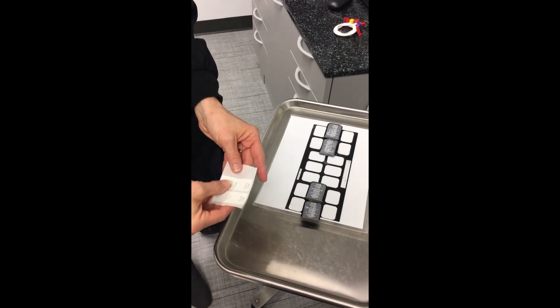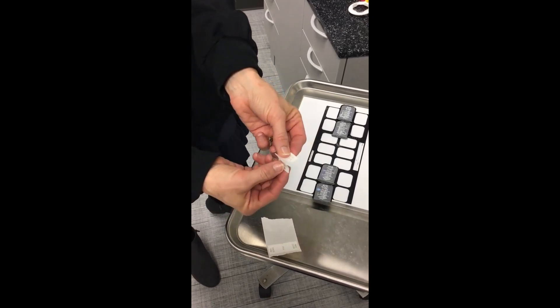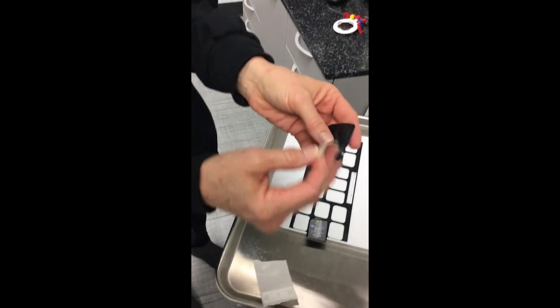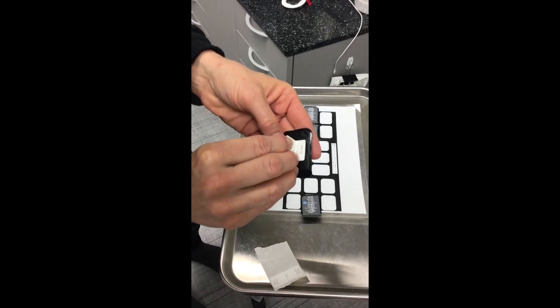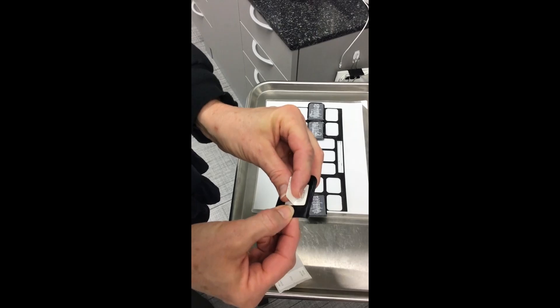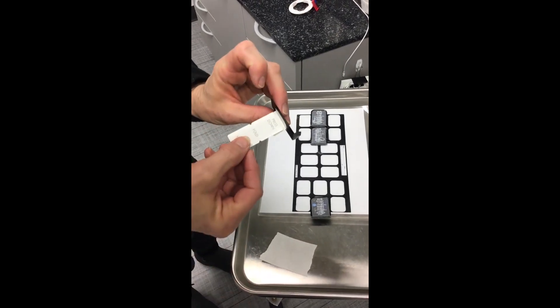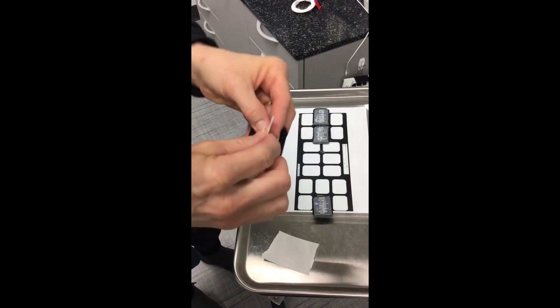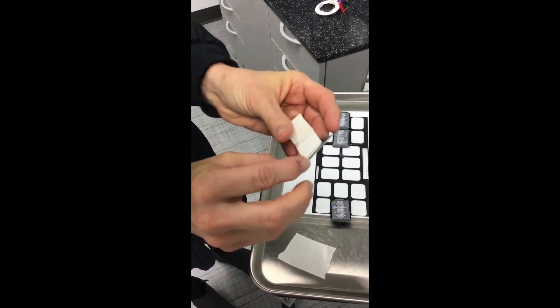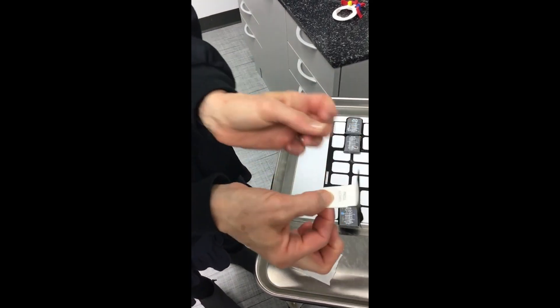Now we're going to demonstrate how to take horizontal bite wings using the tabs. Pull the tab off, fold it in the center, and make it like a little wing or airplane. Take your PSP plate and put the tab right in the center — make sure you're not mistaking the tab for part of your PSP plate; place it right in the center. For your premolar, since we're going to be angling this in the mouth, you can take another tab and place it at the edge to create an extension so you have more to hold onto while your patient is biting.